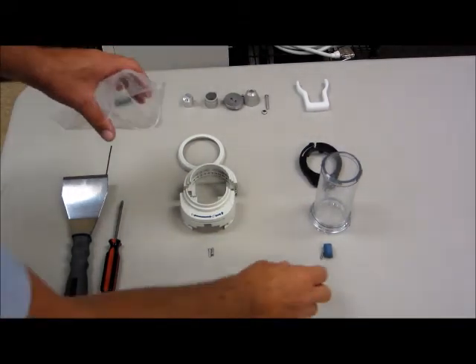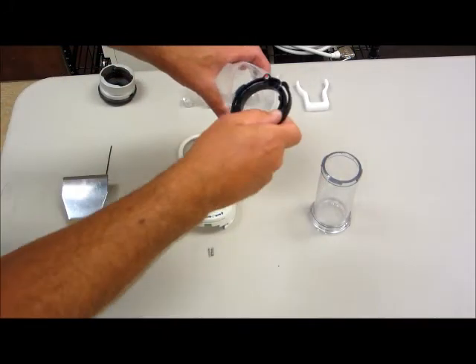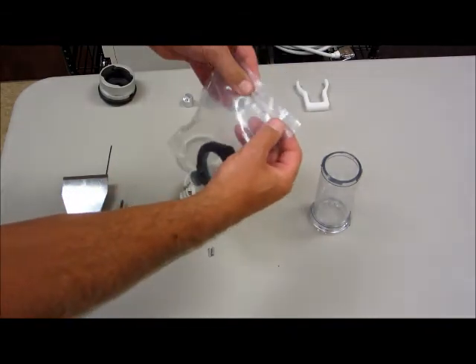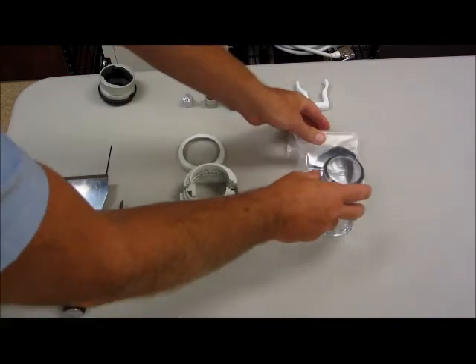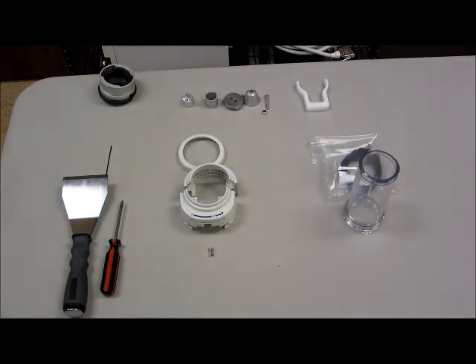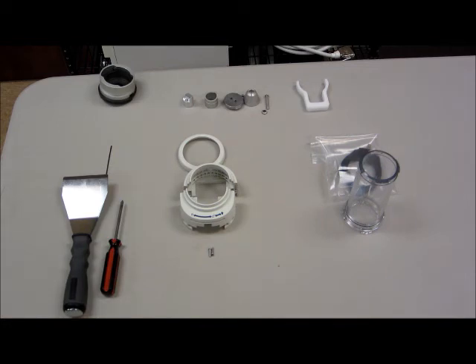Step number four is to place the components you have removed into a storage bag. You can utilize one of the bags that the injector components came in from the kit. What you're wanting to do here is make sure that these are not lost and are given to the account to store in a safe place, in case they ever desire to return to the use of the other syringe and restore the condition of this faceplate.